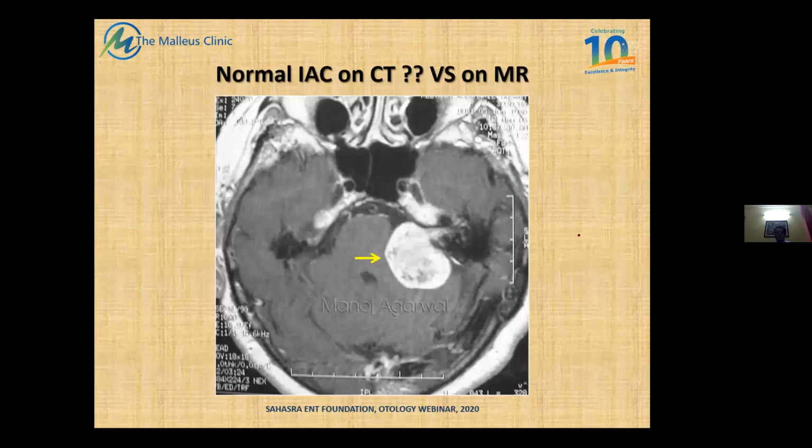Because this is what the patient had. So CT is not the diagnostic modality of a CP angle tumor, irrespective of whether it's a schwannoma or a meningioma or a lipoma or an epidermoid. The point is that an MR with gadolinium has to be performed.